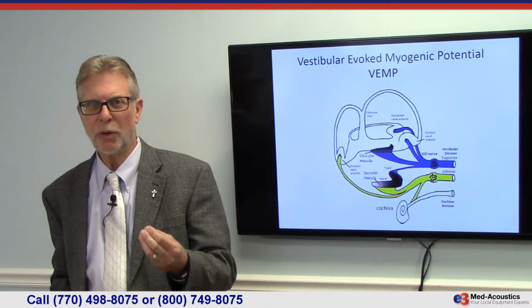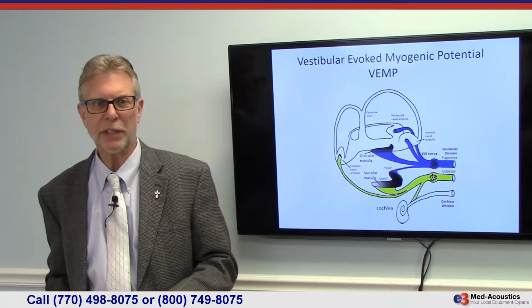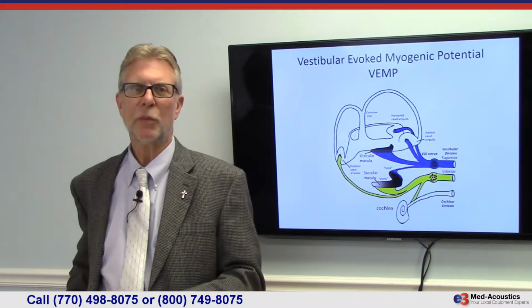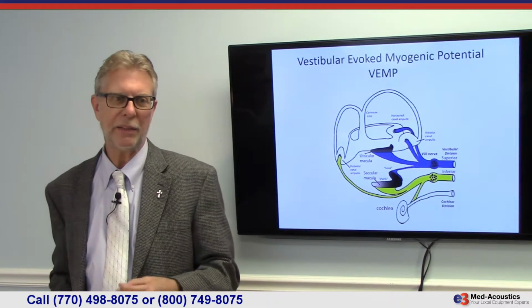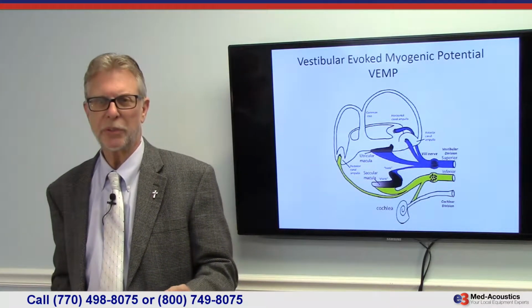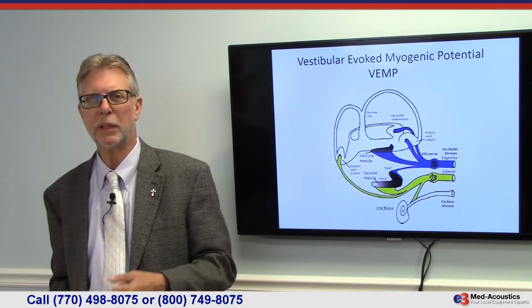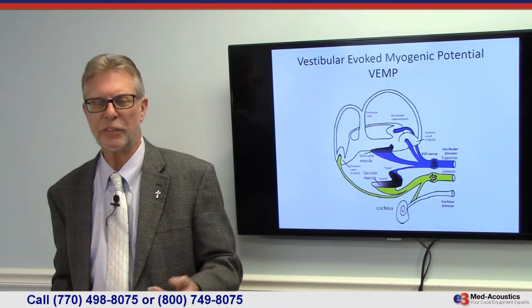Sensitivity is what's all important in vestibular testing. I've been involved in it since the 1970s, and the problem that we had is the sensitivity was very low. All we did is an ENG test, and a lot of times doctors would refer patients that had legitimate symptoms, sometimes acute symptoms, and it would come back with no findings, simply because the test wasn't sensitive enough.